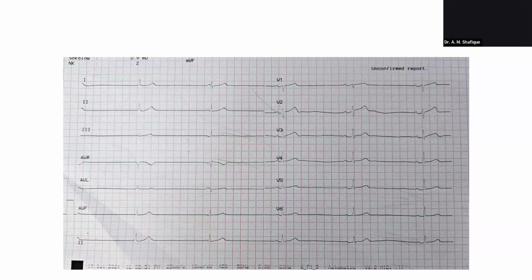But in the previous QRS complex, there is a P, but not the same, right? So altogether, if we put it in a single diagnosis, it should be extreme sinus bradycardia with complete heart block. But definitely it is an ECG of debate. I am not confident in my diagnosis still.